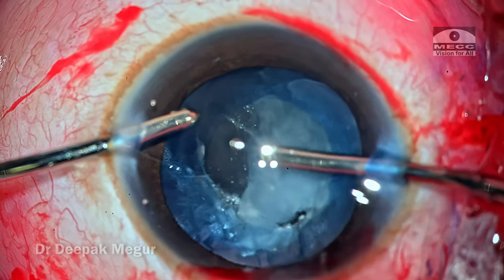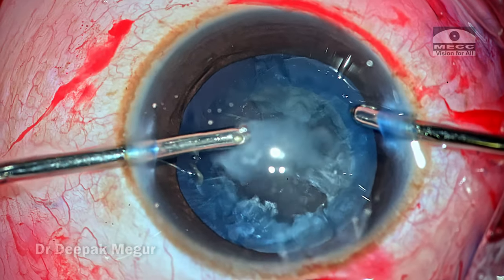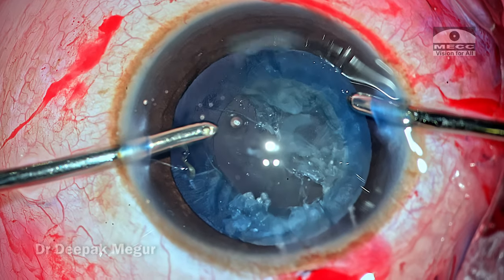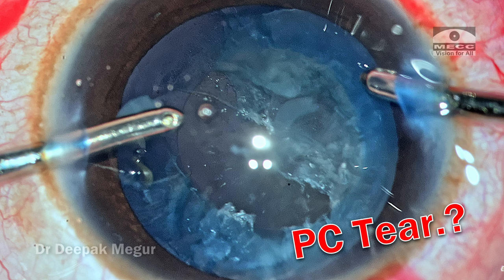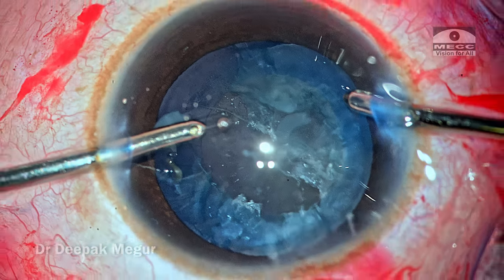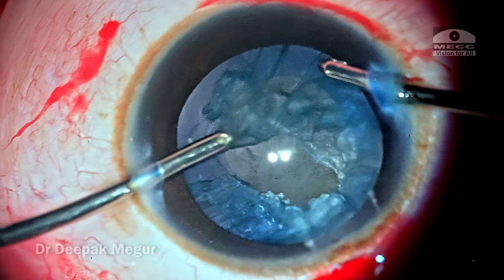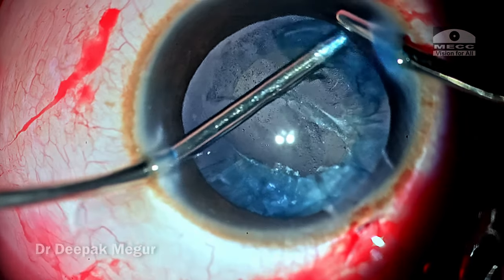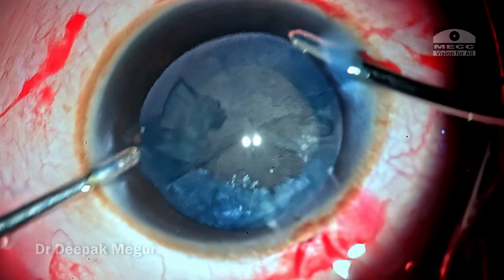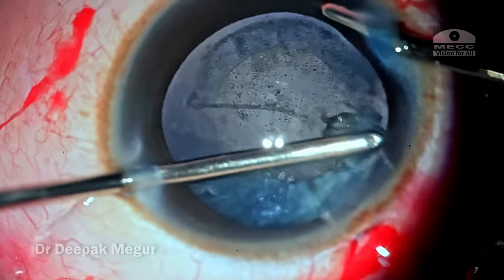The first quadrant of lens matter is aspirated quite easily and the hands are switched to take care of the opposite quadrant. At this point I am seeing a vertical line in the posterior capsule that looks very much like a posterior capsule tear. I quickly realized that the anterior hyaloid seems to be still intact — I do not see any prolapsed vitreous — so gently I am proceeding with removal of the cortex.